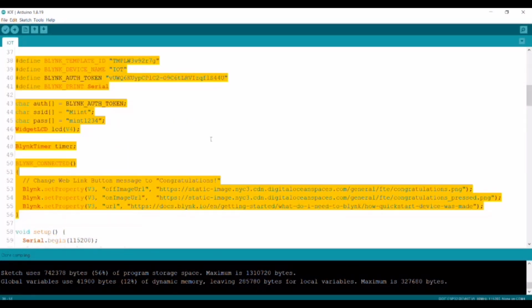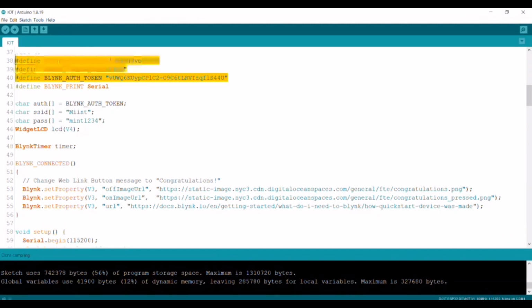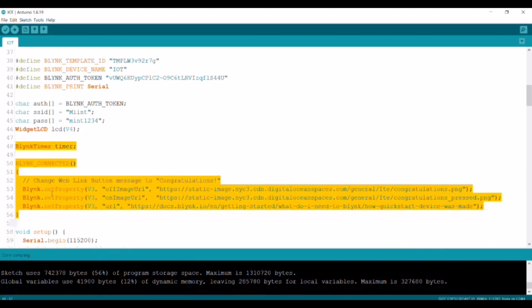And this one, the Blynk application, will pop up after you create a new project in the Blynk application. In each project, it will have a specific template ID, device name, and auth token. This helps us to connect the server in the Blynk application with this code. And this one is for the Wi-Fi user and the Wi-Fi password that we need to connect. I have already created a data stream in the Blynk application, V4, and I will display data V4 in the LCD. And this one displays the message of congratulations in the Blynk application after it connects properly.